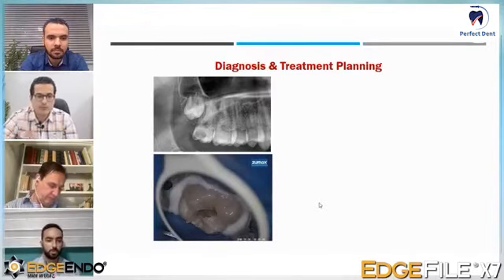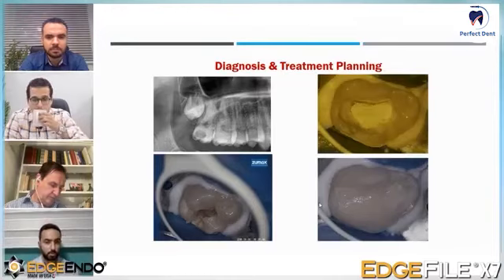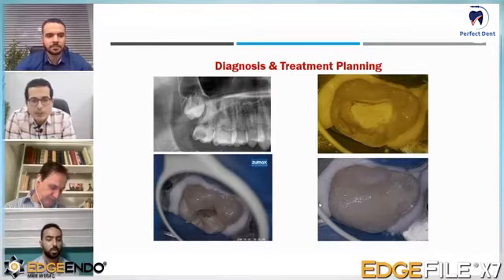So just giving the chance of a vital pulp therapy for this case is a sort of a minimal invasive approach by avoiding root canal treatment. And thus, from the beginning, you should apply your rubber dam if you have this choice. So that's what happened in this case, and we didn't need to do root canal treatment at all.